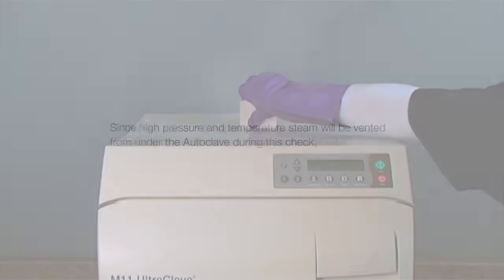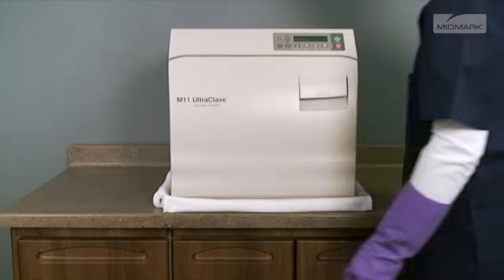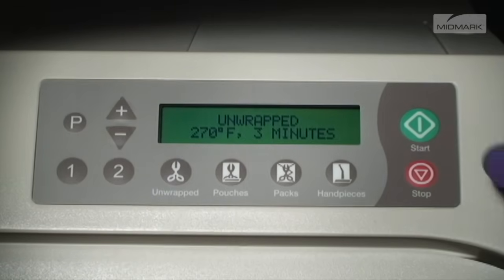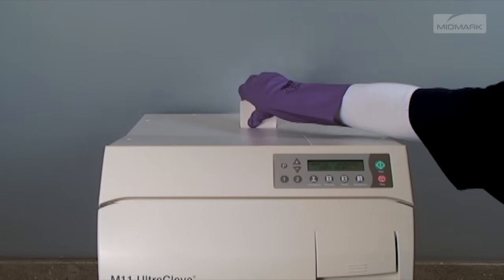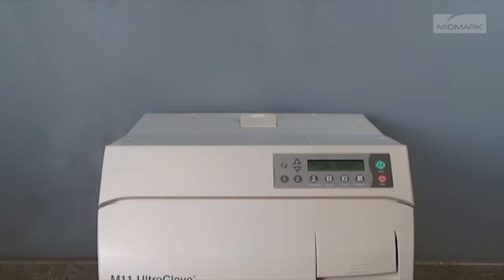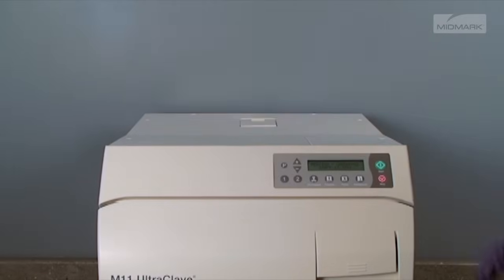The next part of the required monthly maintenance involves verifying proper operation of the pressure relief valve. Since high pressure and temperature steam will be vented from under the autoclave during this check, place a rolled towel around the bottom of the autoclave to act as a steam barrier. Press the unwrap cycle and then start. Monitor the display and wait for the pressure to reach 20 psi. When 20 psi is reached, pull upward firmly on the relief valve lever on top of the autoclave cabinet and hold it open for 3 seconds. Steam should discharge freely from beneath the rear of the unit. Release the lever quickly and verify that the valve has closed properly by noting that steam has stopped escaping.